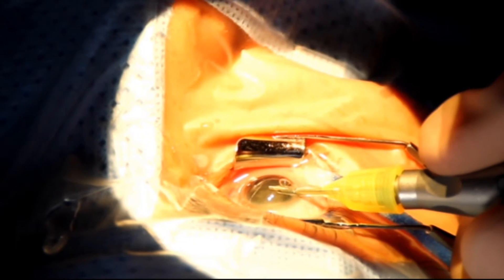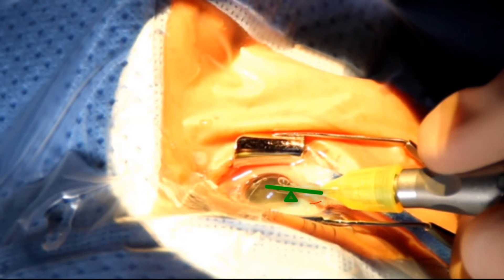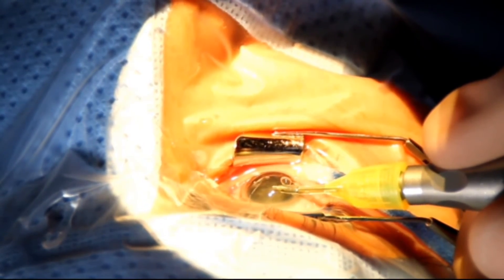As you are moving the probe, use the incision as a fulcrum, and pivot your probe along the incision as you are moving side to side or up and down. By this way, you will have less corneal folds and better visualization.